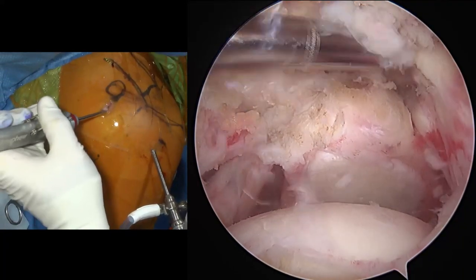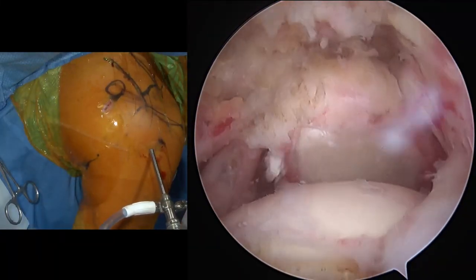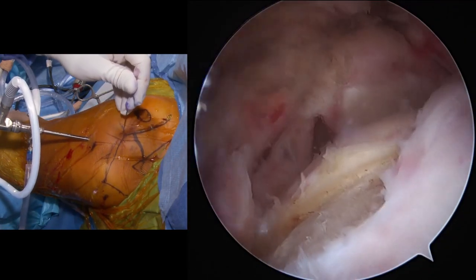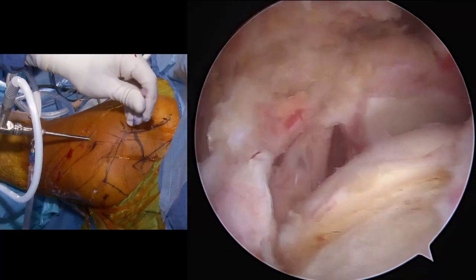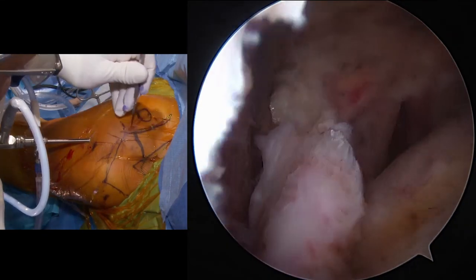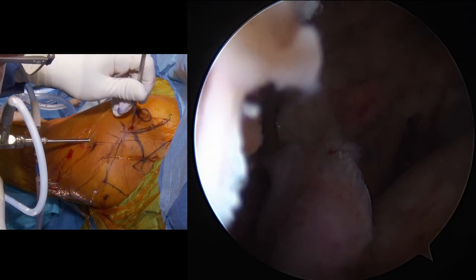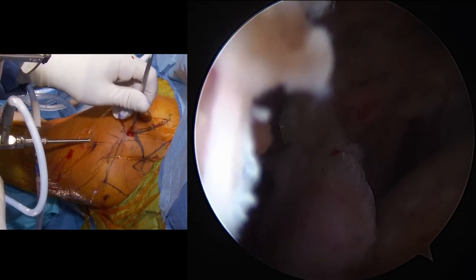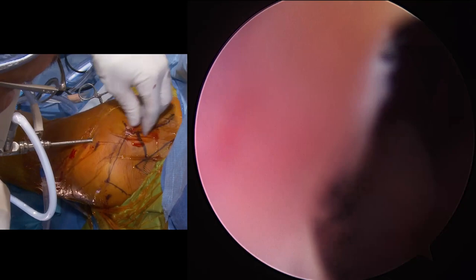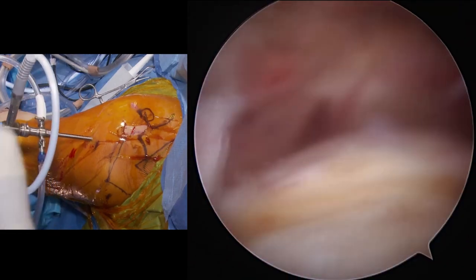I need another cannula. Do you have a purple cannula? Okay, I'll take an 18 gauge needle. So we want to get a good angle here. All right, go ahead and take the needle. This is right off the anterior edge of the footprint, so we want to be up here at anterior superior portal. Take knife back. Okay, can I have the cannula now, please?